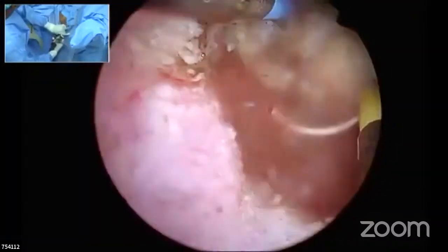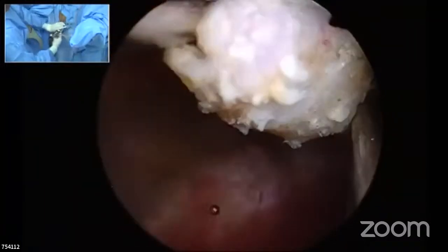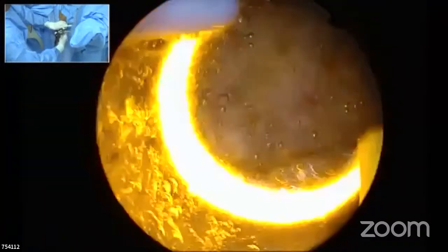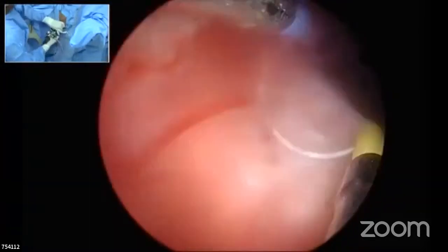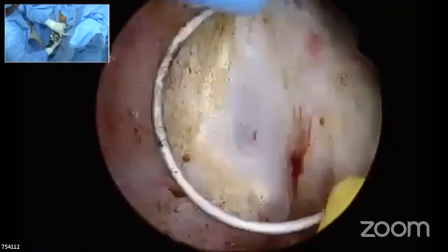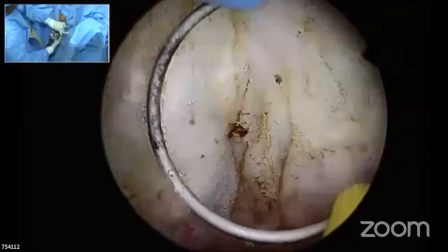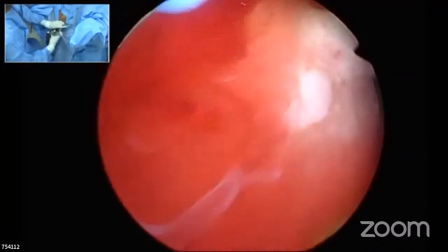Go back again, resect the next level of groove, 1 centimeter below, taking the cue from what you have done above. Sorry, you already reached the capsule or probably thinned out the capsule completely. I didn't notice that muscular spasm happening there.